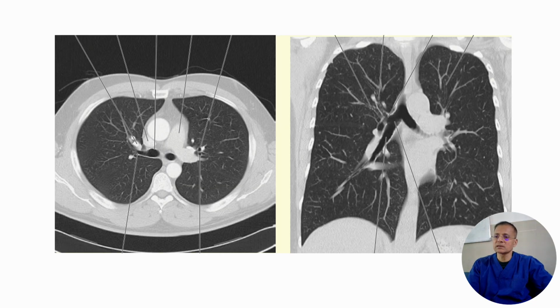Right? So I'll be defining here. So this picture. I want to ask you, can you name this? What is this structure? Right middle. That's correct. Can you show me what is this one? This is also a bronchus, but there are two bronchi seen here. So can you name this? Which one? This one, the arrow. No, this is also rising to the right upper lobe. We said it's the right upper lobe, so this will be continuing to right B3. This is going posterior to right B2.